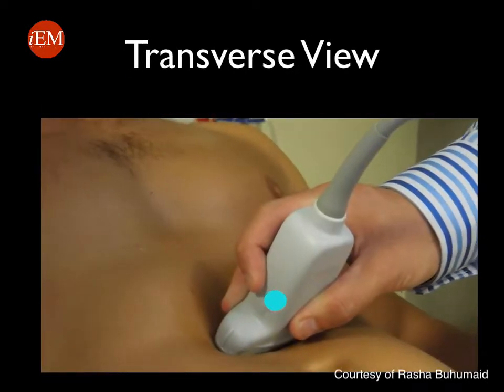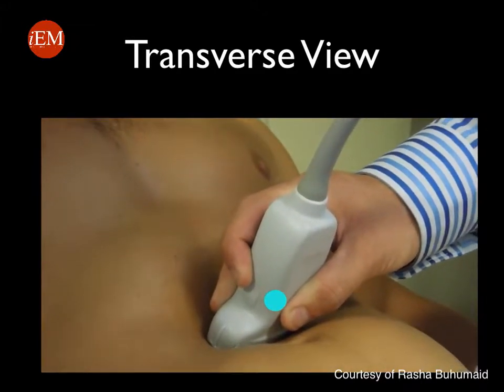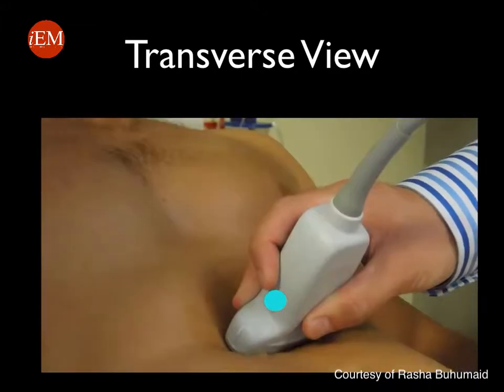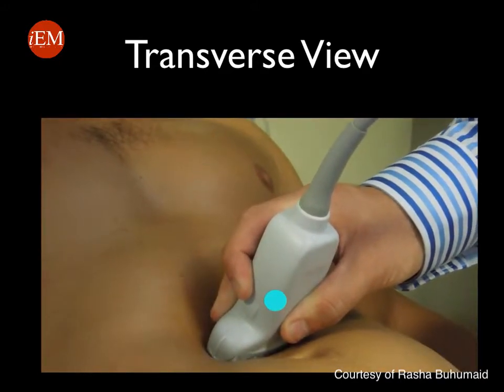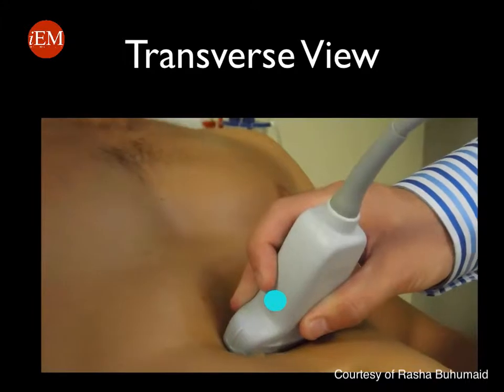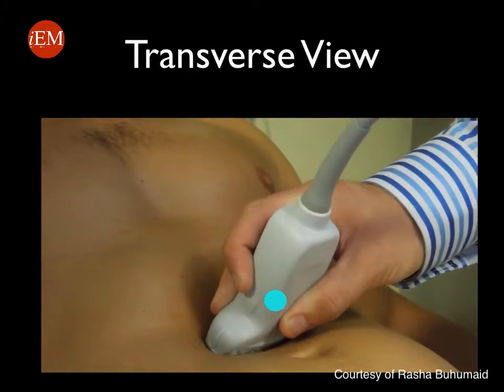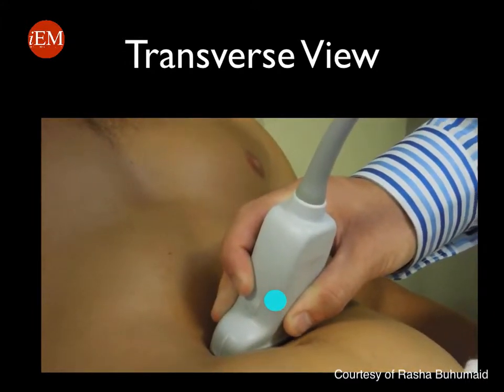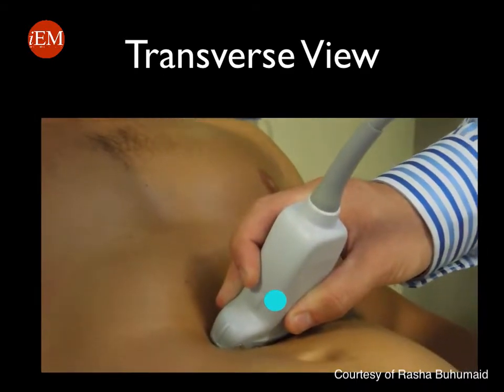You will start at the sub-xiphoid area with your probe in a transverse plane, probe marker towards the patient's right. You will identify the abdominal aorta and slide the probe towards the umbilicus until you visualize the bifurcation of the aorta.